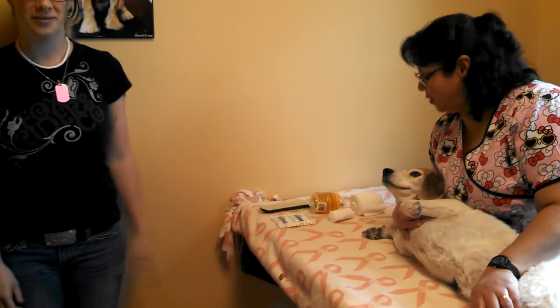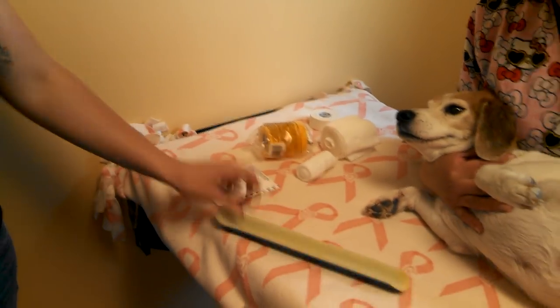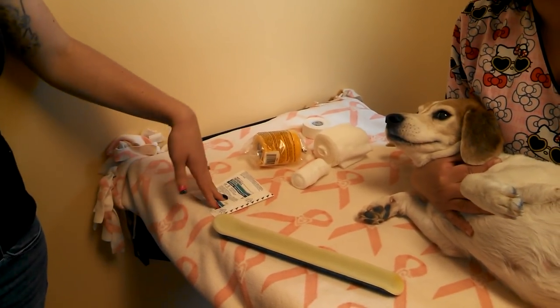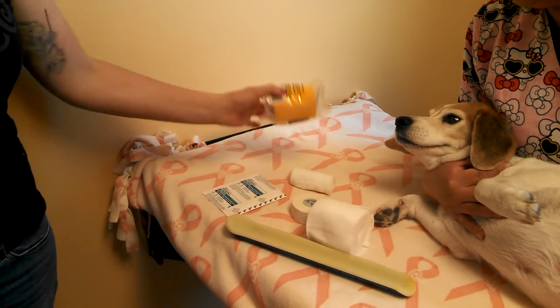So this is doing a spoon splint. You can zoom in on the materials. You need the appropriate size splint for the dog, towel pads if there's any sores or wounds, tape, stretch gauze, cast padding, and vet wrap.